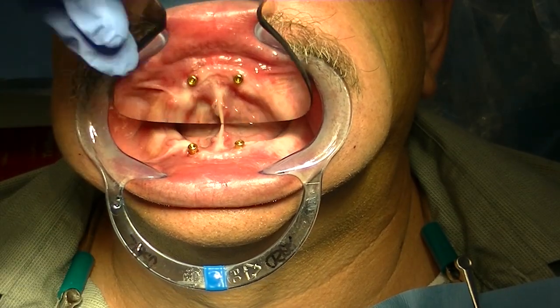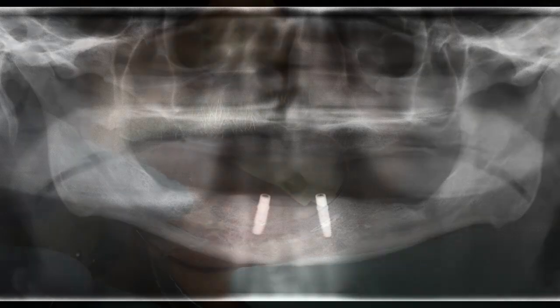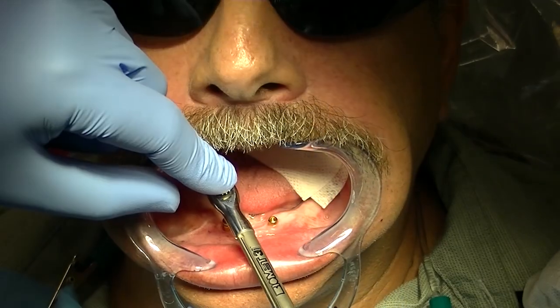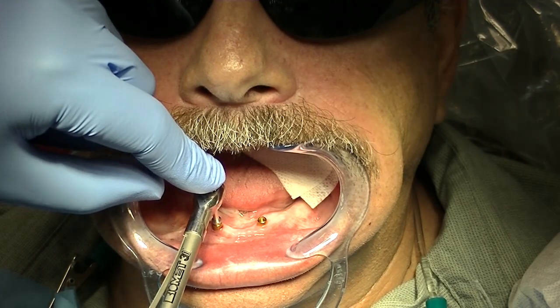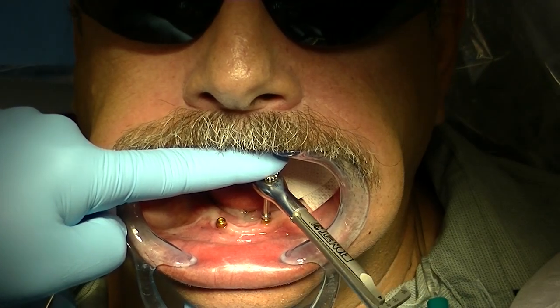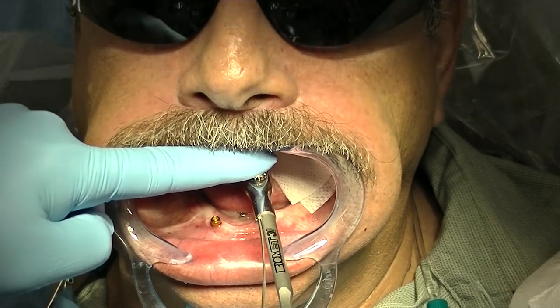What we like to do is go ahead and check our parallelism at this point, as well as do a follow-up panoramic or periapical radiograph to verify that the implants and the attachments are connected properly, ensuring that we don't have any gaps present. Also verifying the torque value for each implant — I like to torque down the locator attachment just with the locator insert on a spring-loaded torque delivery device, somewhere between 20 and 30 newton centimeters depending upon your implant brand.